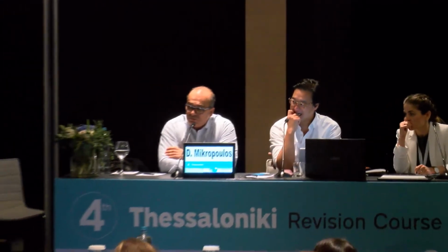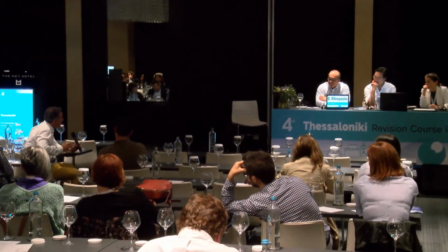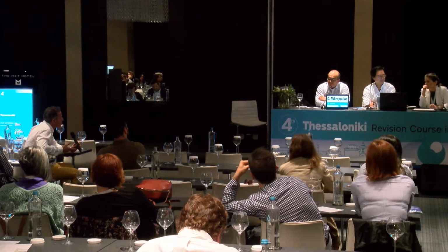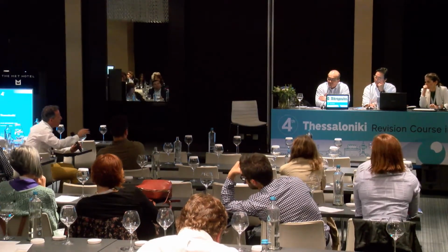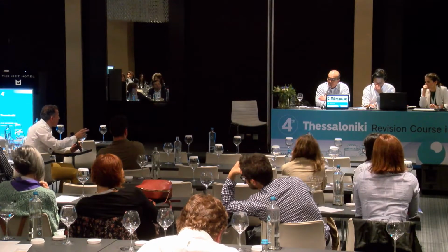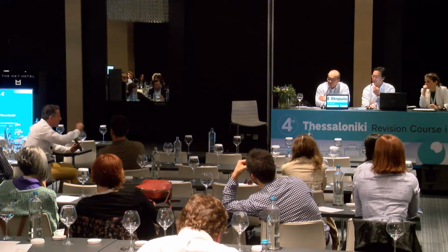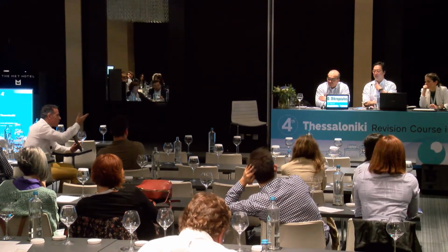Okay. Yeah, 2 questions. As a retina specialist, I see a lot of highly myopic patients, and some of them do have glaucoma. We do know that the reliability of the imaging, especially OCT, but visual field as well, is quite low. Is it a waste of time monitoring them with OCT? If there is a baseline which is abnormal, but you can't quite determine whether it is glaucoma or degenerative changes, can you use this as your baseline and then monitor the progression, or what's your practice?